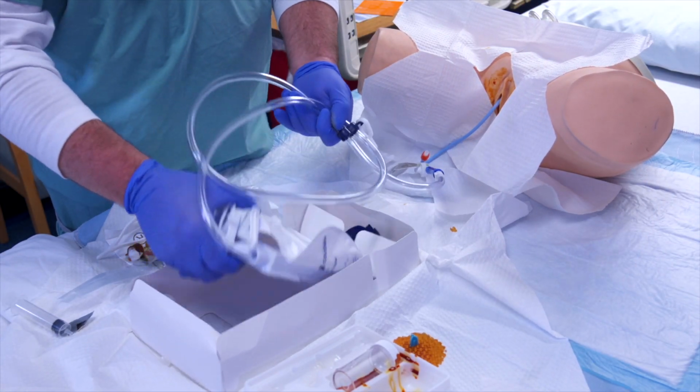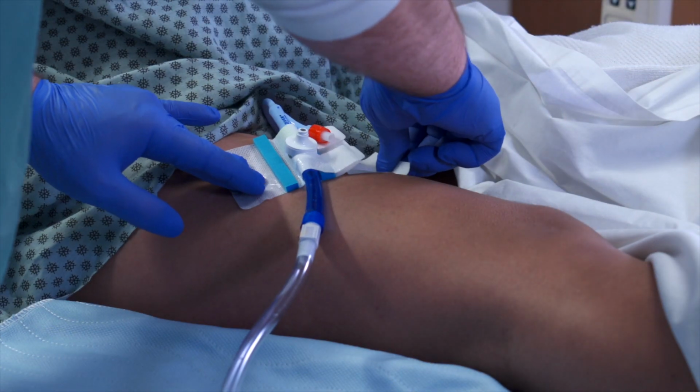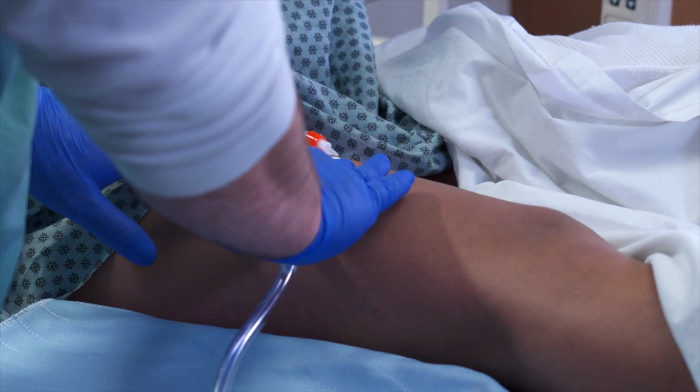Hang the collection bag below the bladder level and secure the catheter on the patient's thigh with a catheter securement device. We will be reviewing steps to properly secure the catheter in detail later in the video.